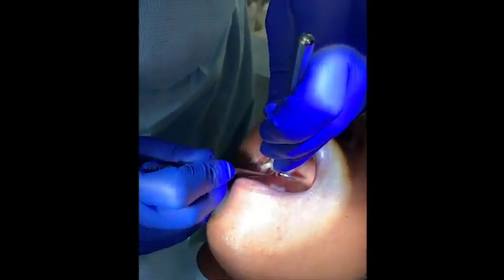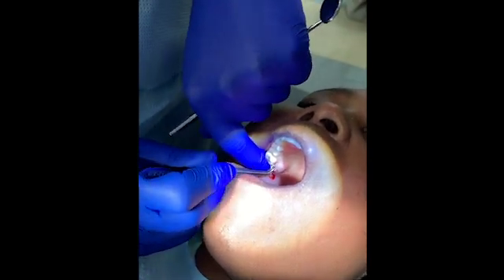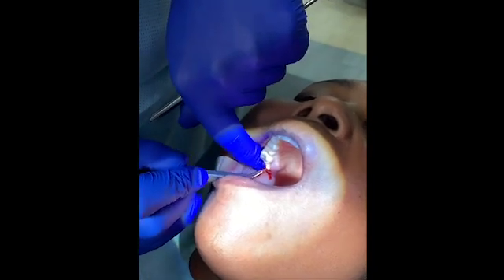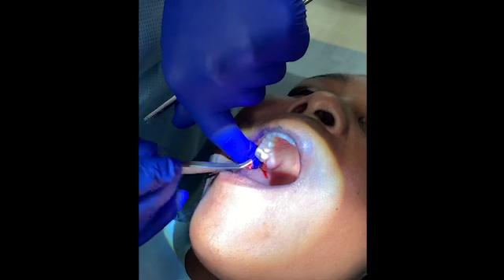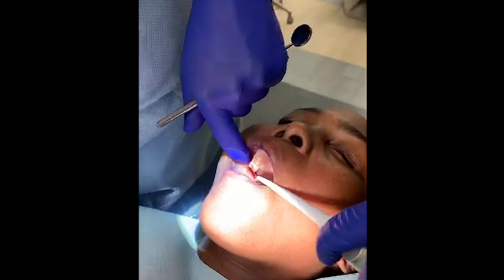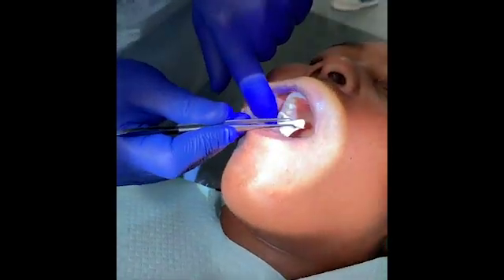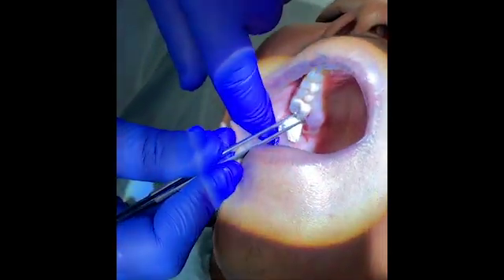The key is to try to keep the instrument as dry as possible. You can see it almost turns into like a gel, so we're going to go ahead and just condense that. We have the other piece of the BioViva to just put in there because it was such a large socket — you can see as we start putting it in.